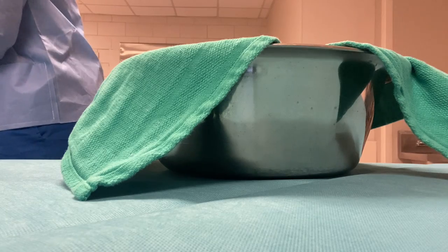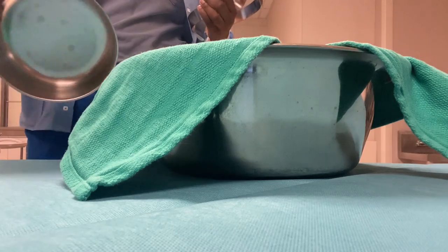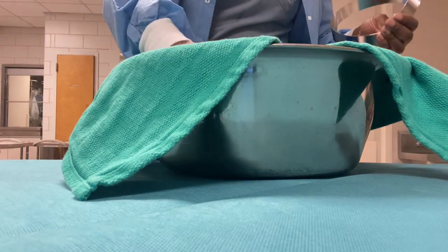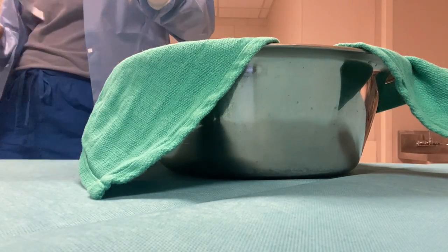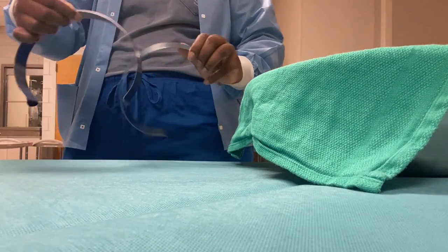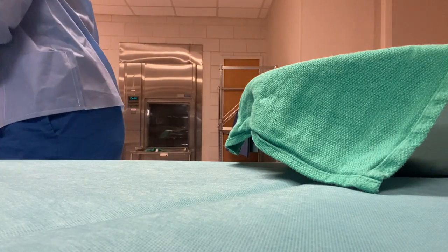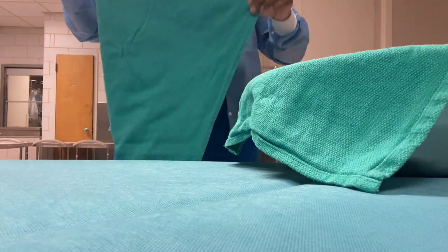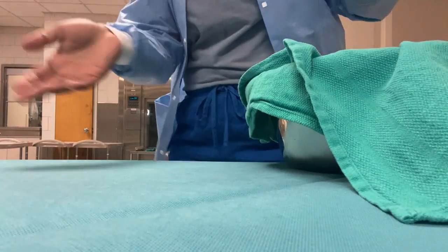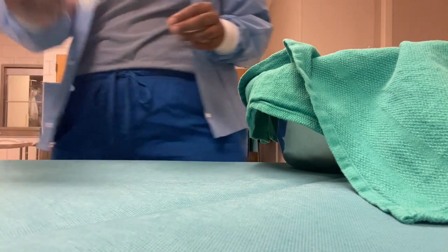So first on my count sheet, I'm gonna get the big things out the way. So first it will be my big, large metal bowl, the proper name for it. Leg bands, it's two of them. Another towel. Put it the opposite way. Indicator.